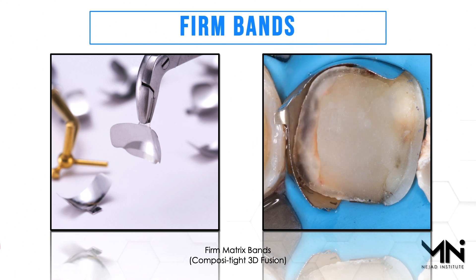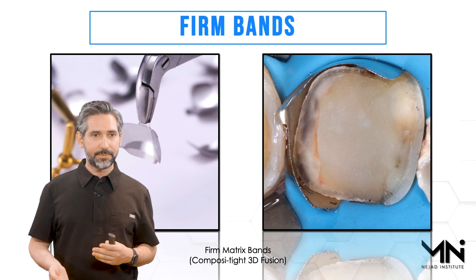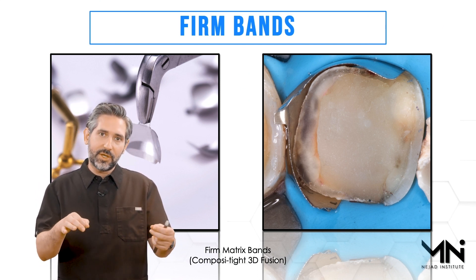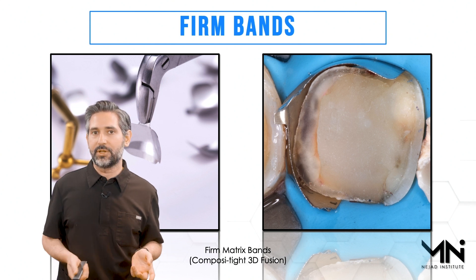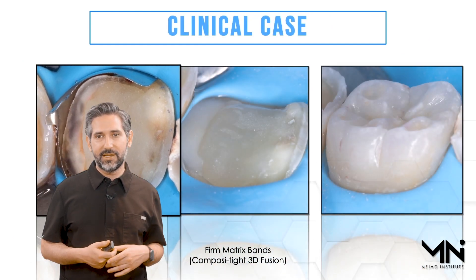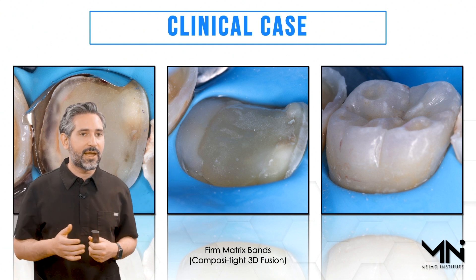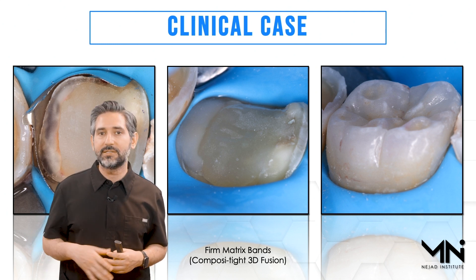That's where the Firm Matrix 3D Fusion band from Garrison comes in — it has a very stiff contour so look how nicely it can stay in place. I can place that in there without anything else, or if I need a little extra adaptation I can place some Teflon tape on the outside of the band to put a little pressure on it. Also, when you use the rubber dam and get this band between the rubber dam and the tooth, when the rubber dam is released it has a rubber-band elastic effect pushing it against the tooth.